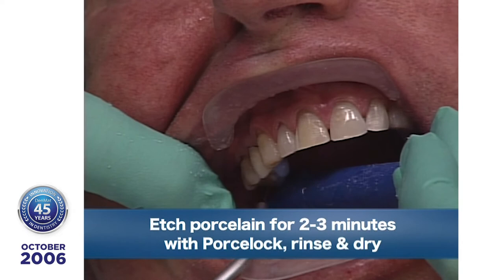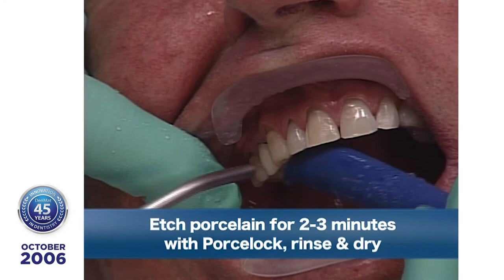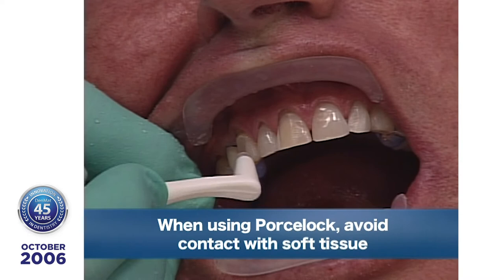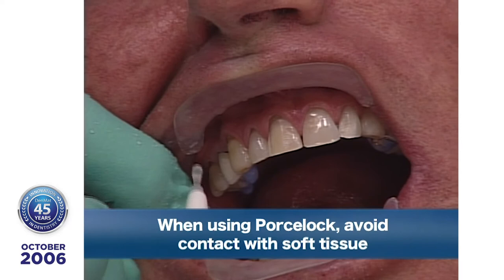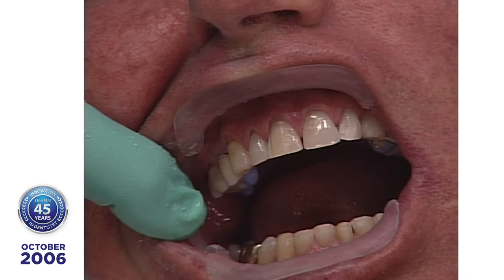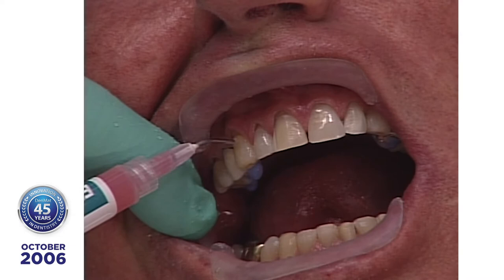Now you want to be sure that you get all the hydrofluoric acid removed, because the only thing that neutralizes hydrofluoric acid is calcium. And once it gets going into the tissue, it keeps going until it reaches bone, and on the way it passes periosteum. Okay? Yes, this is porcelain conditioner, right? And that is an organic acid. That's very important that you remember that, because if you try to use an inorganic acid, such as hydrofluoric acid, on porcelain, it won't activate the silane.